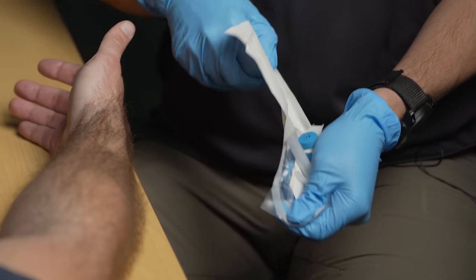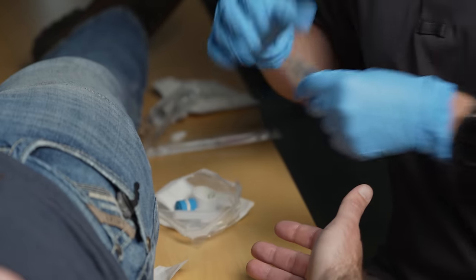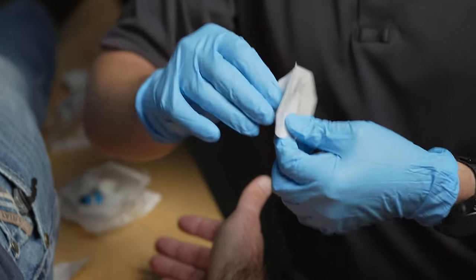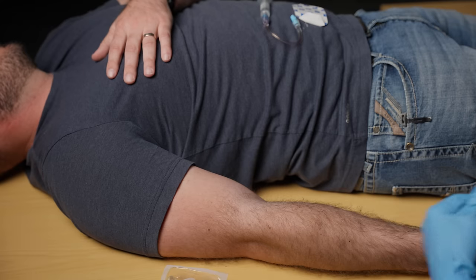If you've worked in EMS or healthcare for any amount of time you've definitely started an IV without proper prep and then you're trying to hold tamponade on that IV while getting everything ready, and it just doesn't work very well. So I've got the Tegaderm here and I'm just going to make sure the tab is undone so I can peel it really easily.